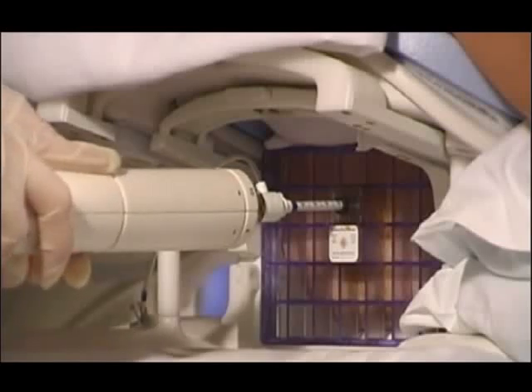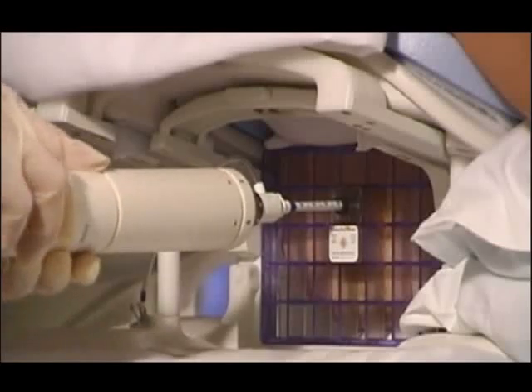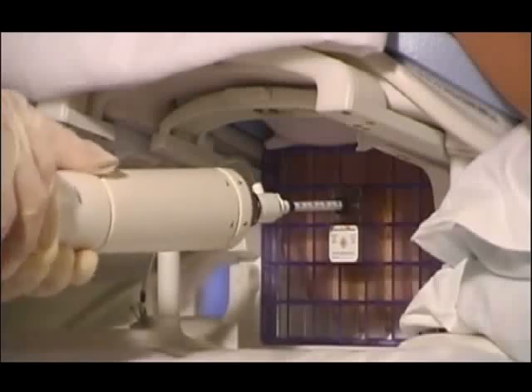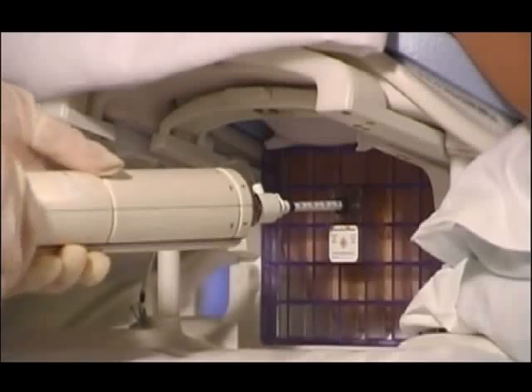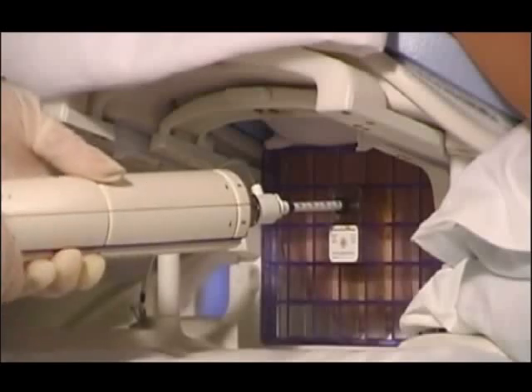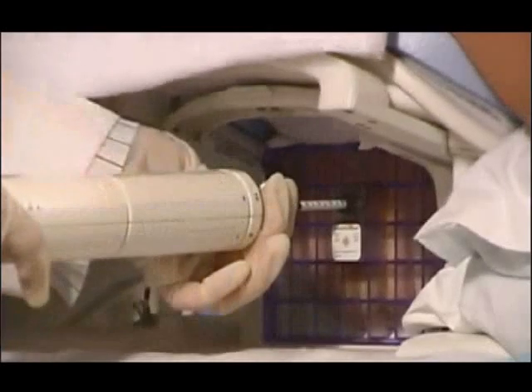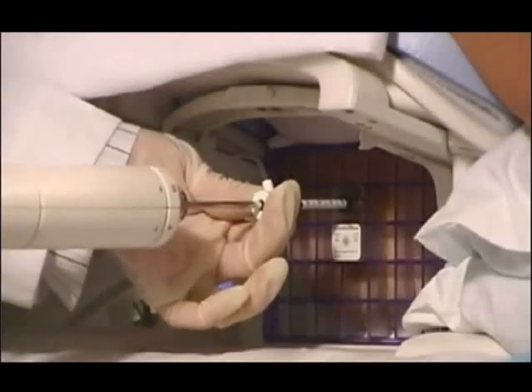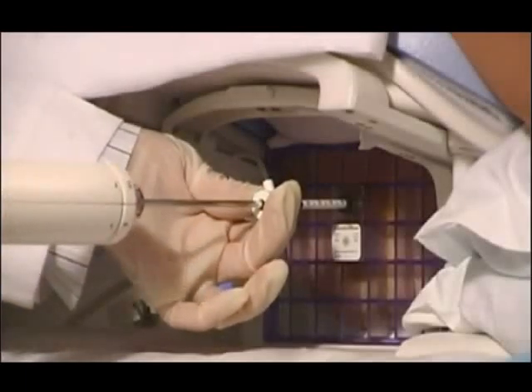Total tissue acquisition time is typically less than 60 seconds. Cores are collected in the tissue collection filter, reducing fluid exposure on the magnet. Once the biopsy is completed, remove the ATEC MRI handpiece, leaving the introducer sheath in place.